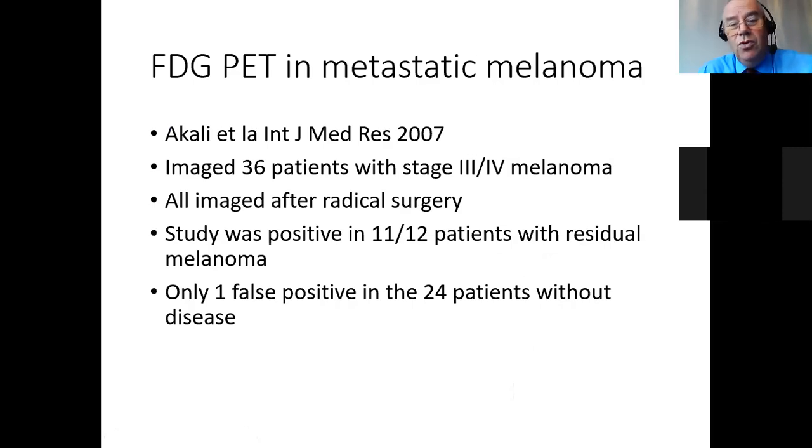With stage 3 and 4 disease, then clearly PET is much more useful, and in the majority of patients it tends to be positive and can be used to guide further surgery. There was one false positive patient, but these are rare in melanoma patients. But like anything, remember that FDG is a non-specific agent.